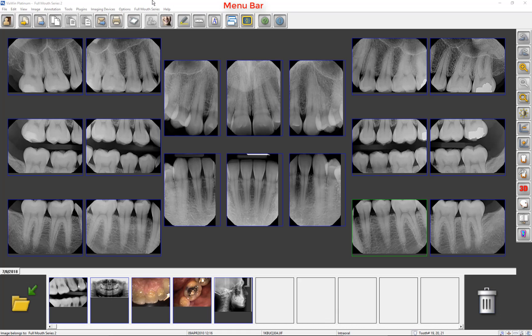These access points are the menu bar, the toolbar, the sidebar, and by right mouse clicking on an image. Most of the commonly used tools can be found within the sidebar by default.